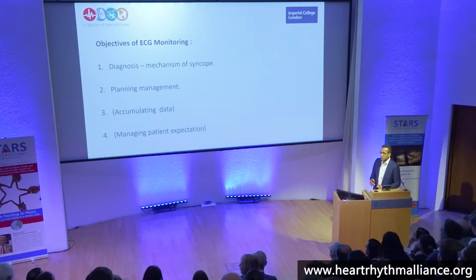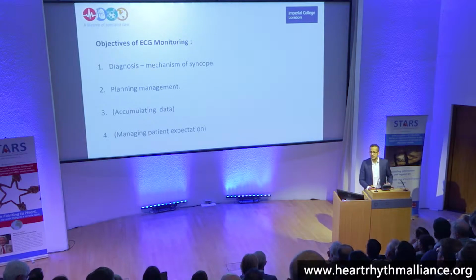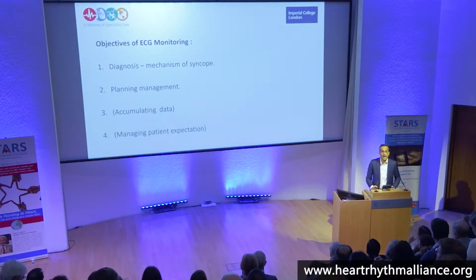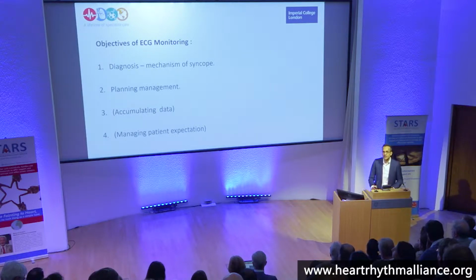I've put 3 and 4 in brackets here because accumulating data I think is important. I think it's very easy, and wrong, to act on your first description of arrhythmia. Accumulating a wealth of data in an individual patient is probably the right thing to do.